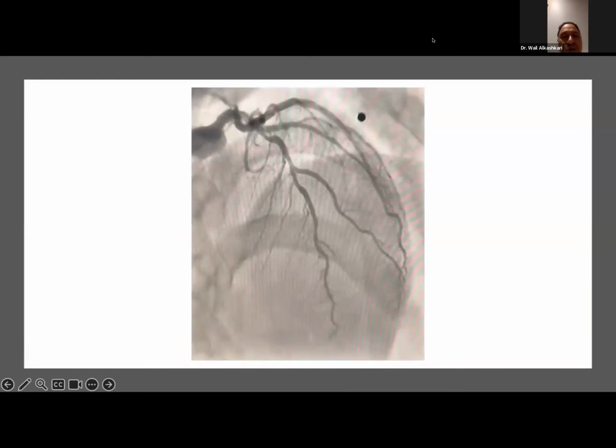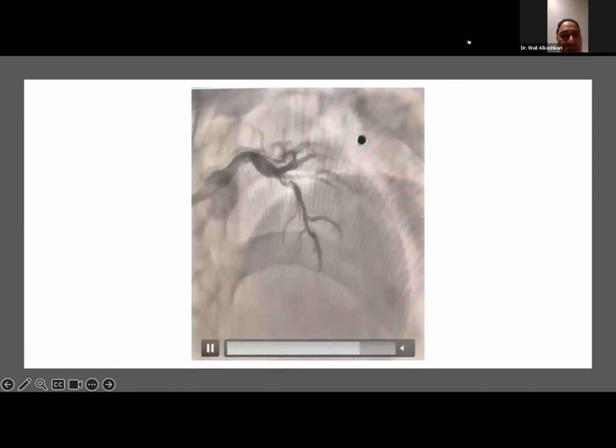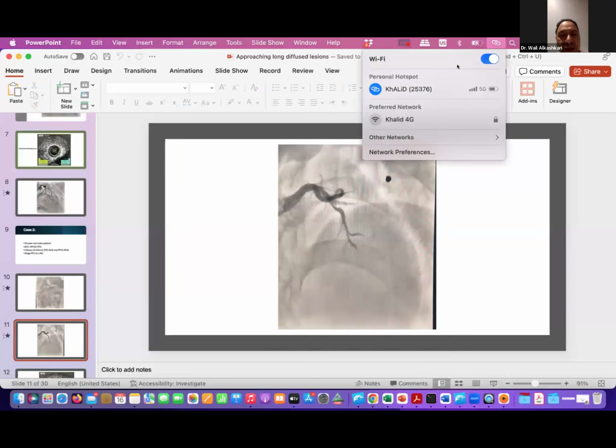So interesting. So the first case you used Nagomi in acute setting, not a stable setting, and which is also well described in the literature, and that Ultimaster also do good job in case of acute coronary syndrome, and it's non-inferior to any other stent.